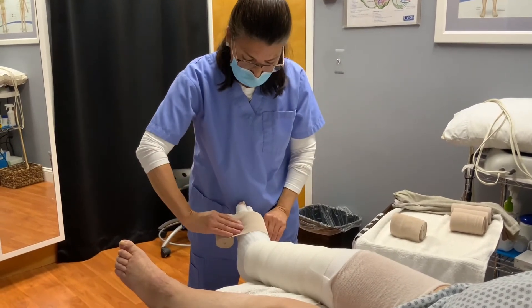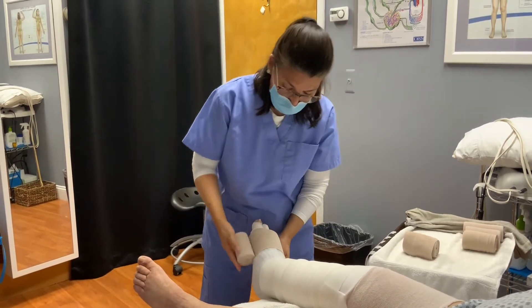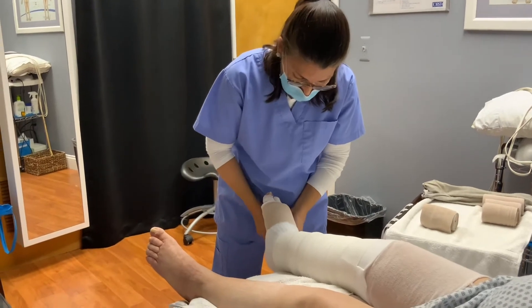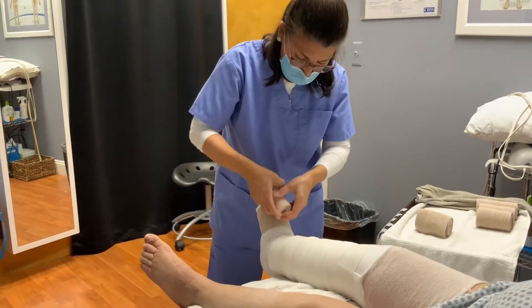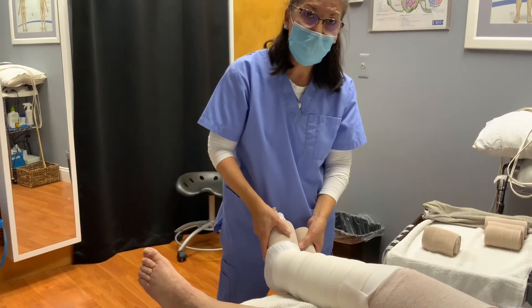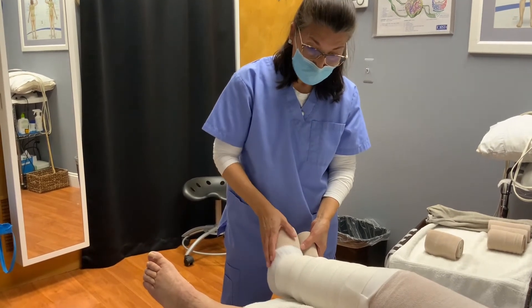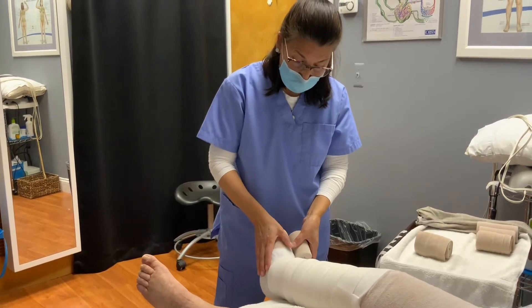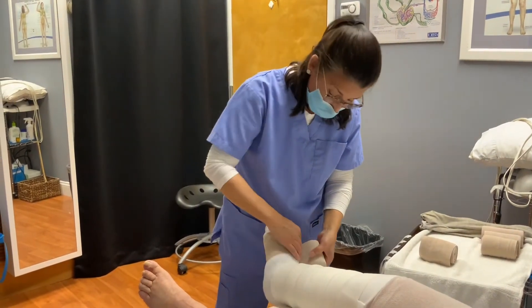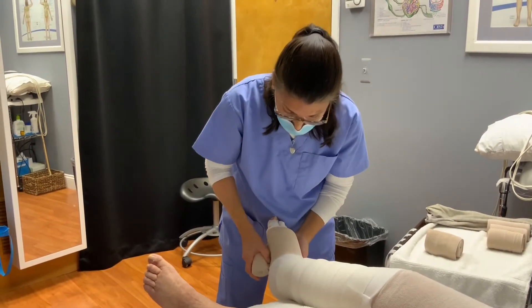You don't want to have to pull the bandage — think of it like a snail, it should roll easily. You want to start at the base of the toes, anchor it well, go around it once, and give it a little pull to stabilize it. Not to the point that it's a tourniquet, but enough that it's snug to help push the fluid in the upward direction. It's going to be a bit more compression at the foot. Today I am demonstrating a circular bandaging technique.